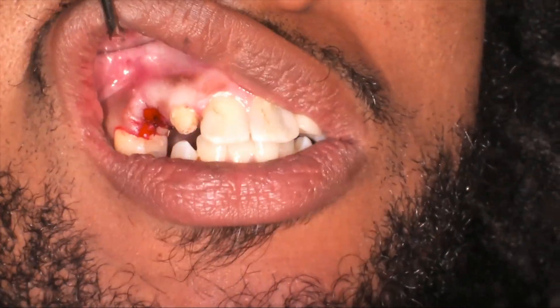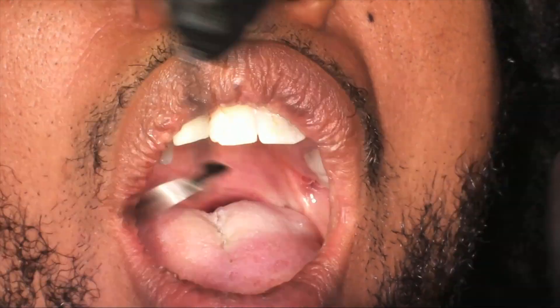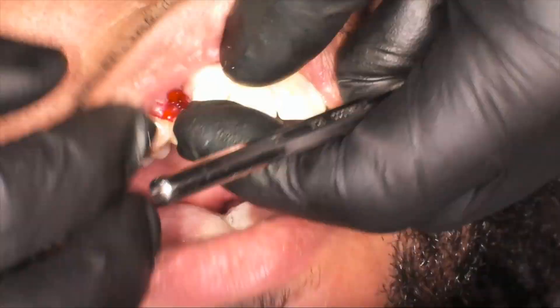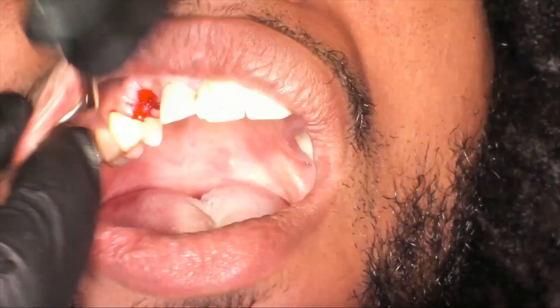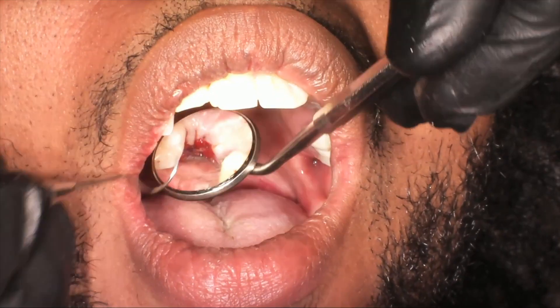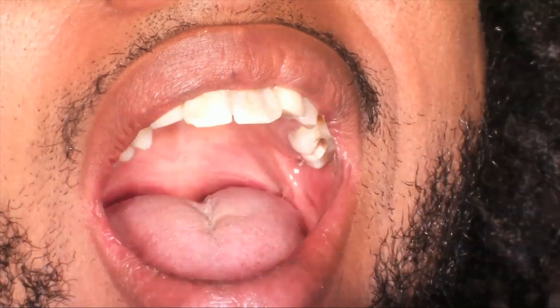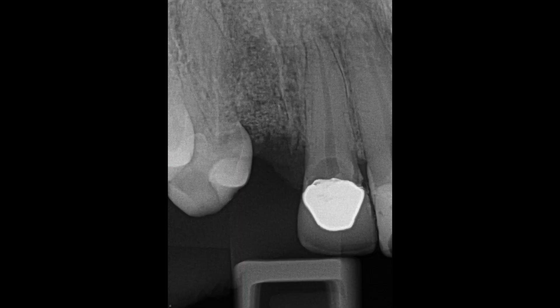We're going to clean site number seven and glue number seven's crown back on. We did notice that seven had some decay on the lingual — talked to the patient about it. Our next step, once we get to number six, is to place a number six implant and do a cantilever from six to seven, then extract number seven. Our crown is back on and the patient case is done. We had an Essex retainer made from a printed model, and here is the post-op x-ray showing the decay on tooth number seven, which we'll deal with next.